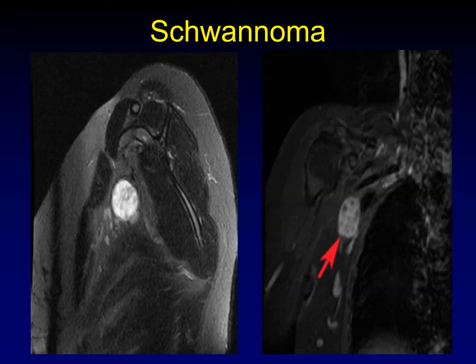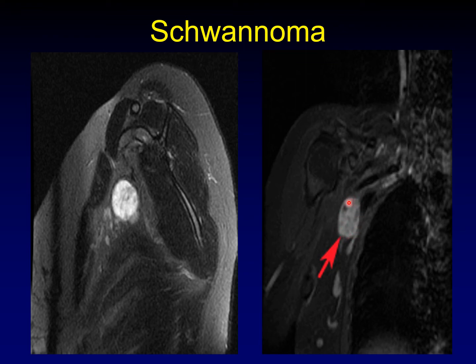Another example — this time a sagittal T2 and a coronal T1. You can see that it is elongated along the length of the nerve.